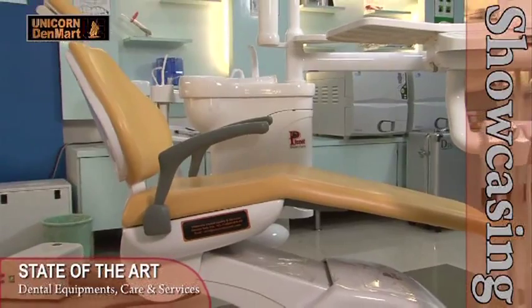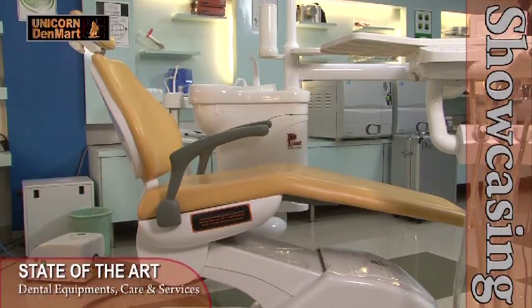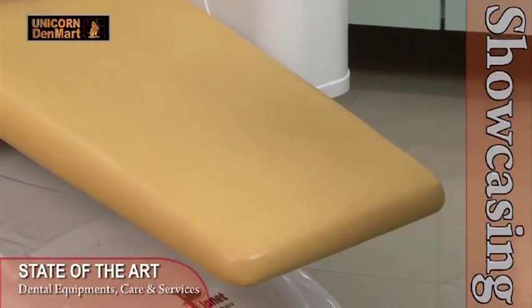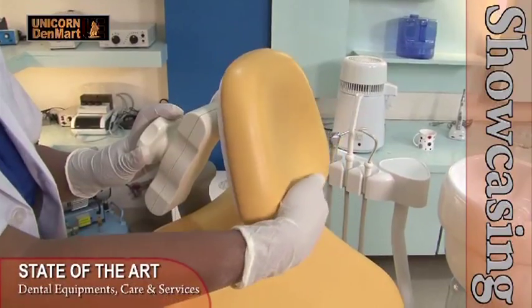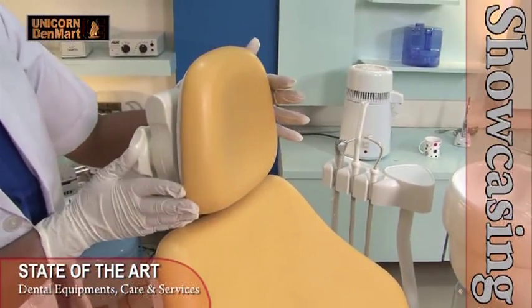The most economical, affordable and highly convenient Planet comes with a wide back seat and chair for superior patient comfort. Furnished with seamless upholstery material that prevents adherence of dust. Its double articulated headrest makes the unit suitable for patients as well.